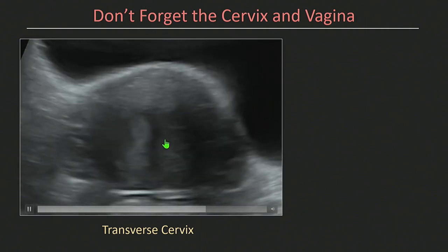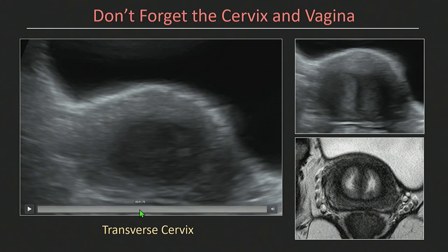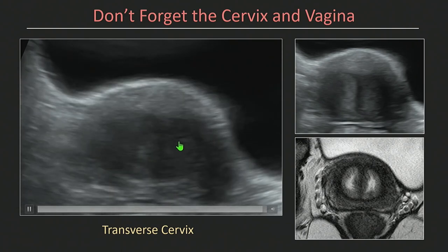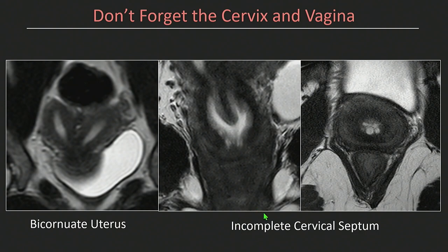Don't forget the cervix and the vagina — you can often find septa or duplication of the cervix. In this case of a bicornuate uterus, as we scroll through, there's a band between the cervix — here it is on MR. This patient with a bicornuate uterus was undergoing IUI. The septum in bicornuate uteri often does not extend to the external os, so on exam you only see one external cervical os. But if they're undergoing IUI, you'd like to know where you're going, because in fact there are two separate cervical canals — a potential pitfall for IUI.